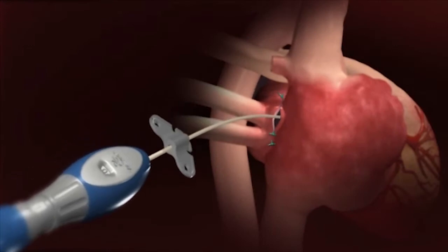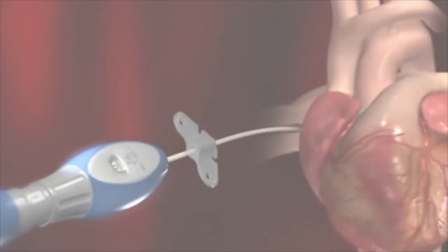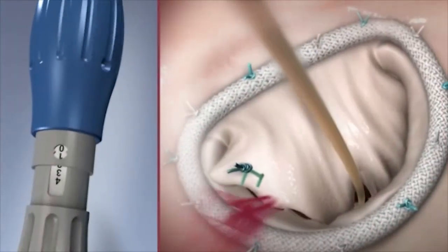The heart can now be resuscitated with the device handle still inside. Under echo guidance, the surgeon can now adjust the cord length to optimize leaflet coaptation.